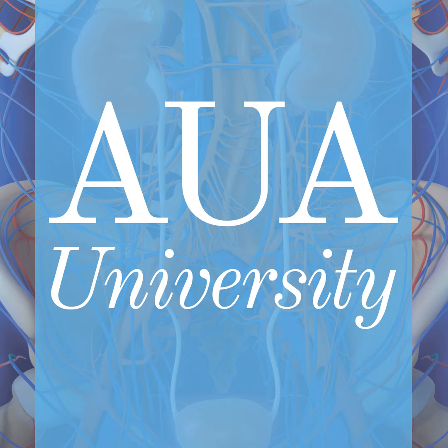And when we looked at the PSMA PET scan, there was a nodule just close to the wall of the rectum. And you can see this nodule also here, which is not infiltrating the rectum, but is in very, very close vicinity to the serosa of the rectum. So the question now is, what kind of approach would you use in this situation?